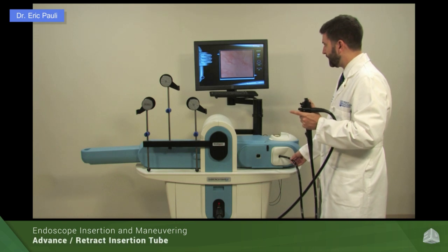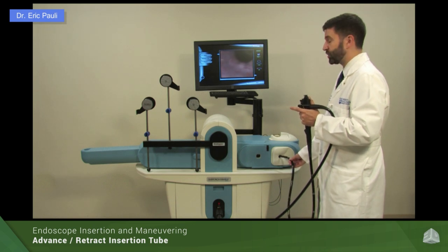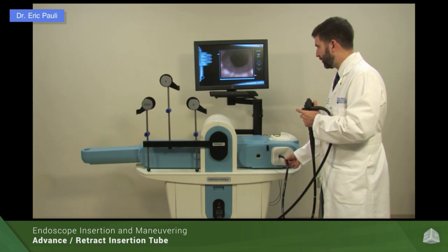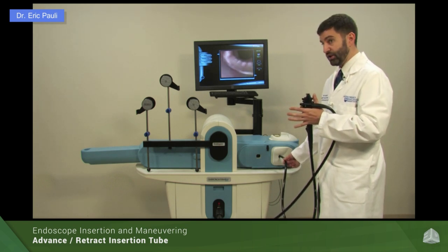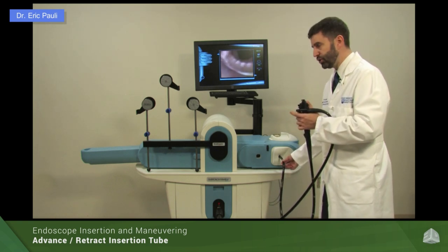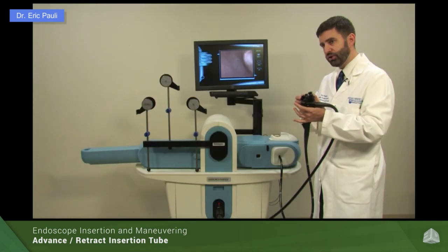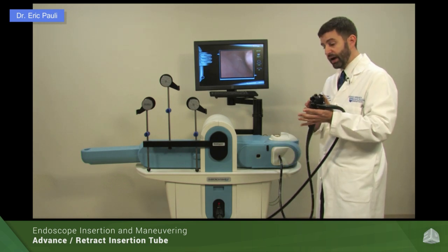The right hand works the scope in and out. There are times where the scope may migrate back from position due to looping or peristaltic motion that continually moves the scope back. You may find yourself needing essentially three hands — when you take your hand off the insertion tube the scope is moving, but at the same time you need to get back to the control knob to do a maneuver. In those circumstances, you could have an assistant hold the insertion tube, or you can actually work three-handed.